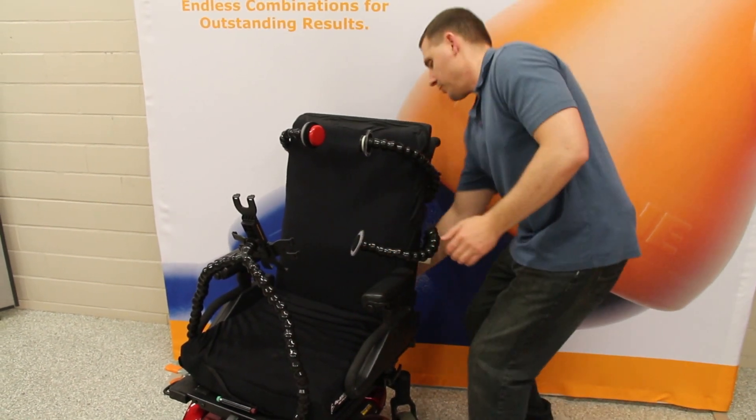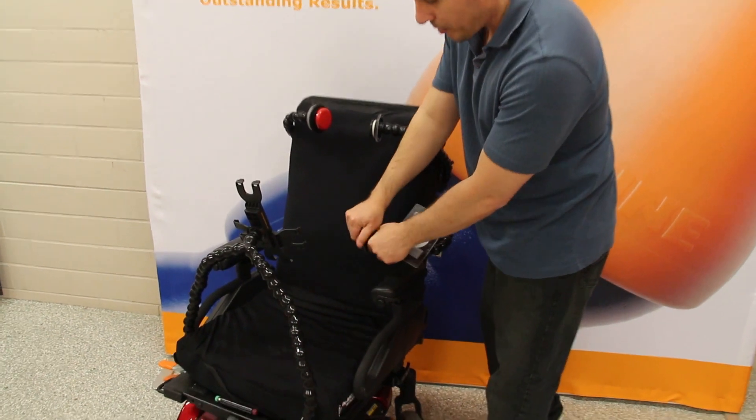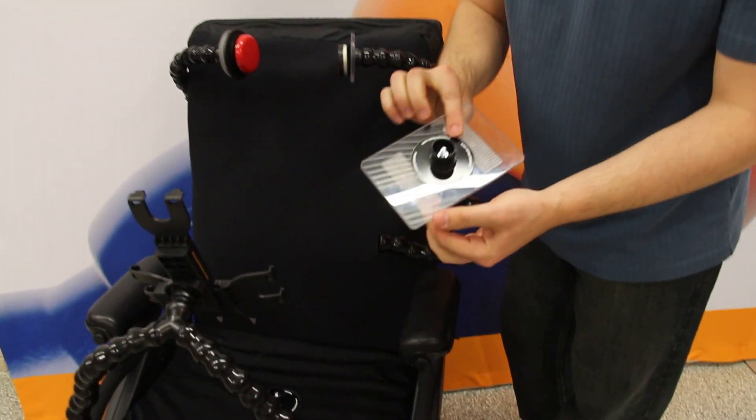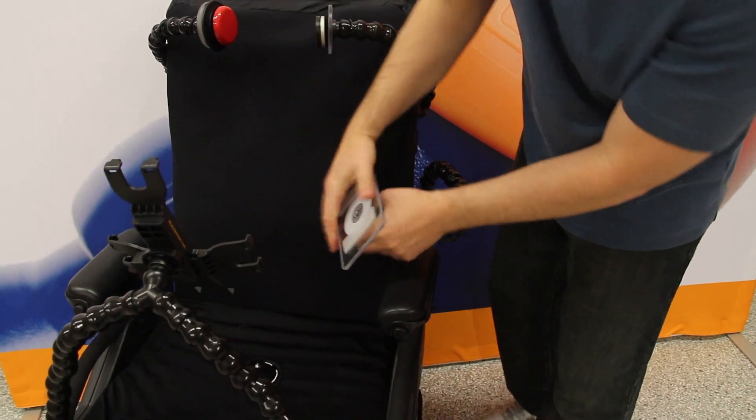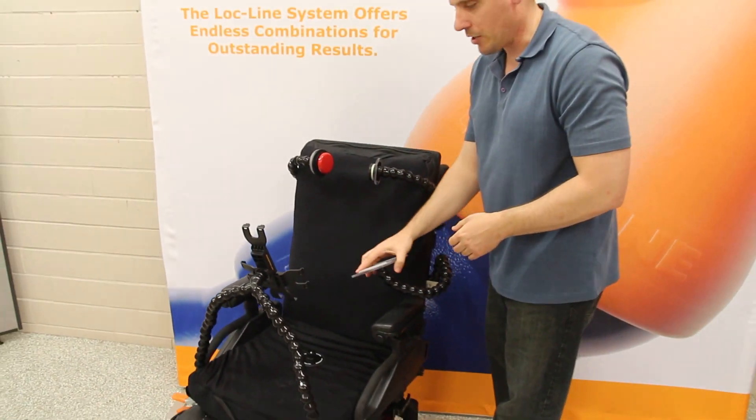If you wanted to mount something different instead of using a 3-inch disc for a switch mount, you can just pop that off and get the 4x6 plate, for example, pop that on, and now you can use it for holding a telephone or holding another lightweight communication device.